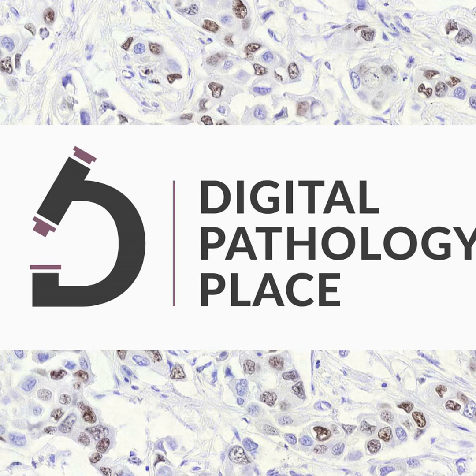Central to these guidelines were 5 pivotal principles. 1. Technological standards, which ensured secure, reliable transmission of high-resolution images and patient data. 2. Personnel training, emphasizing the need for proficiency in technical and clinical aspects of telepathology. 3. Quality assurance, advocating for routine maintenance and regular assessments of image quality. 4. Data security and patient confidentiality, underlining the importance of encryption and Health Insurance Portability and Accountability Act, HIPAA compliance. 5. Regulatory compliance, reinforcing adherence to regulations like CLIA.